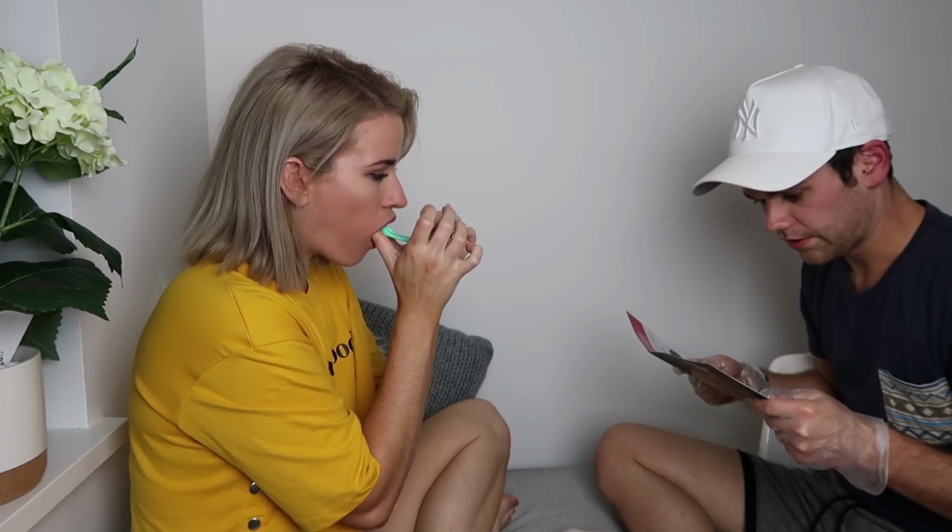As soon as the tray is ready, carefully place it in your mouth, applying even downward pressure when inserting. Don't push the front down. Once in place, allow to set for 3 minutes. Don't move your tray or your teeth during the process. After 3 minutes, gently remove the tray. It will be difficult to remove, as normal. Check the impressions again. Why didn't you read this?